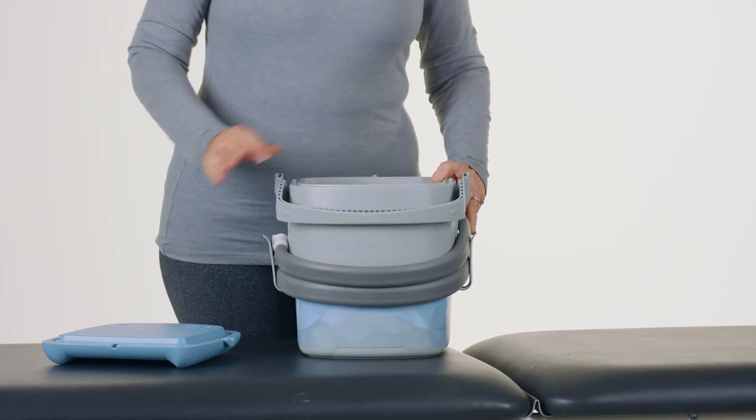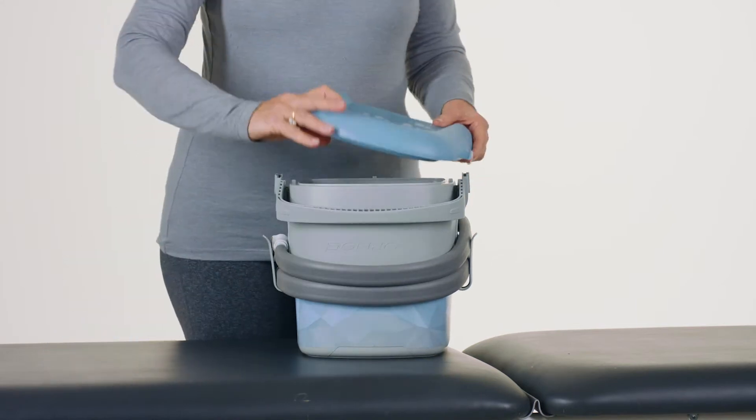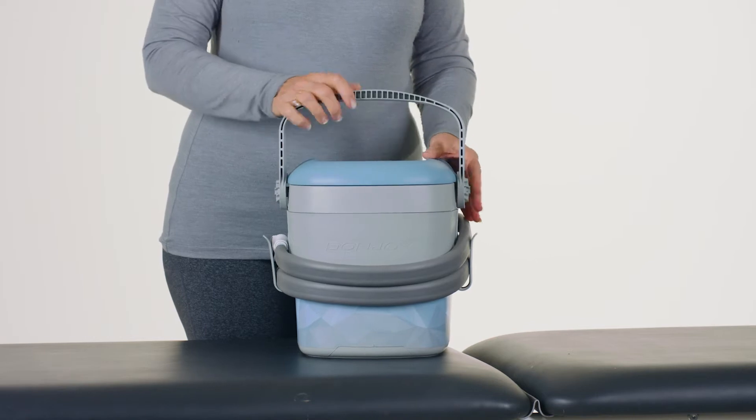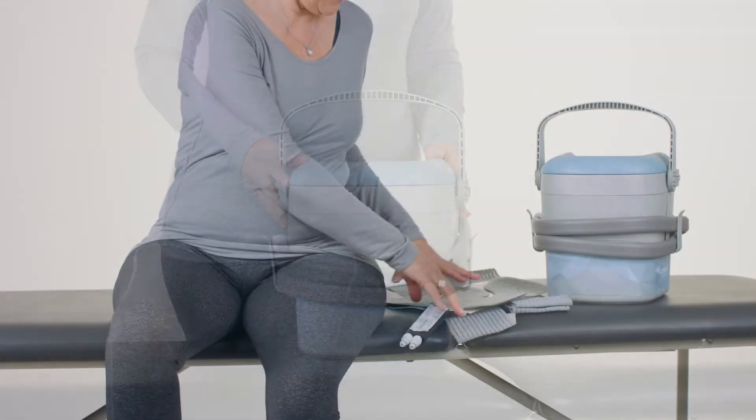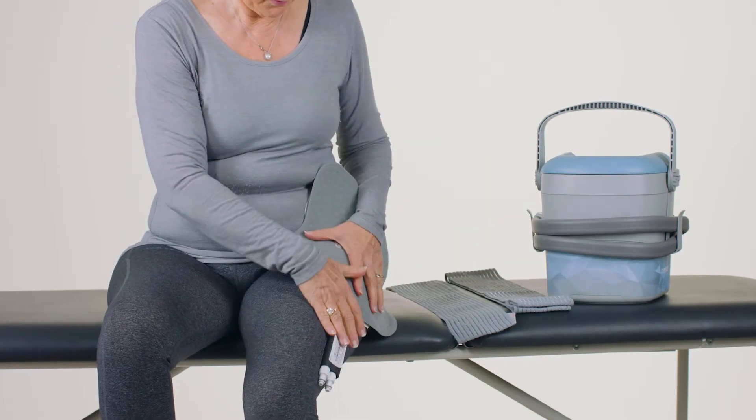With the handle in the forward position, place the lid on the device. Press the lid down while rotating the handle up and back to latch the lid closed. Set aside while you apply the cold unit pad and the hip brace.